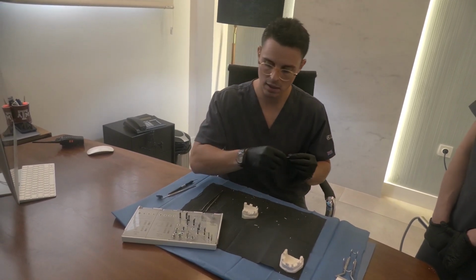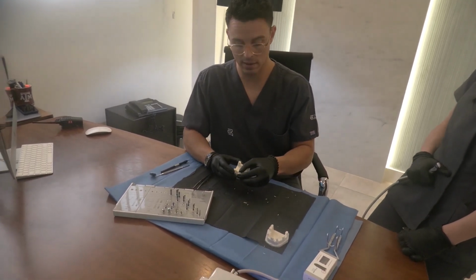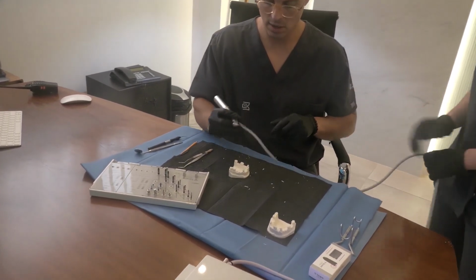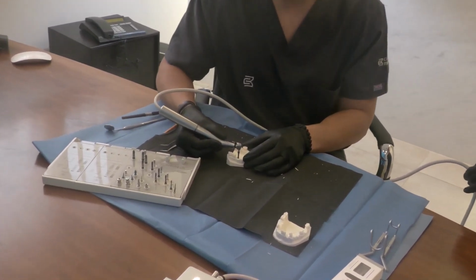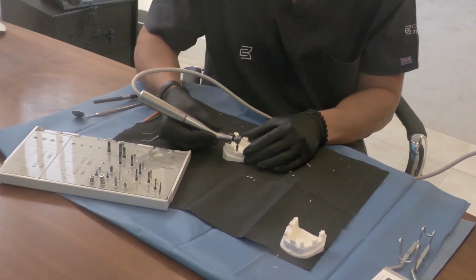We're going to apply it accordingly, simulating that we are placing an implant in the posterior mandible, where the bone tends to be very dense in terms of quality, and where the cortical bone layer should be pretty thick. So again, up to the working length.